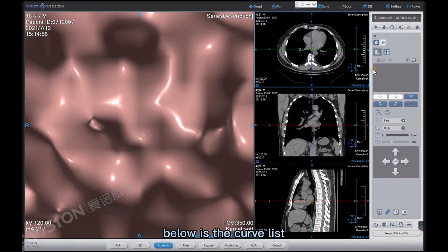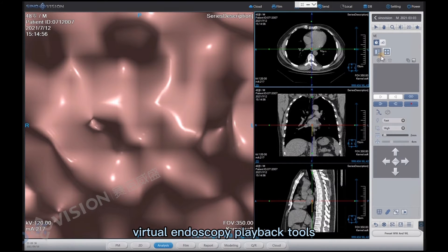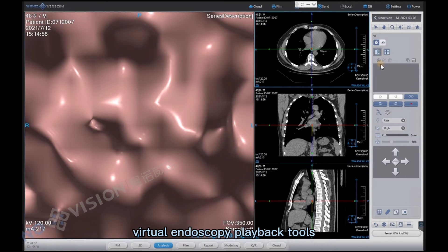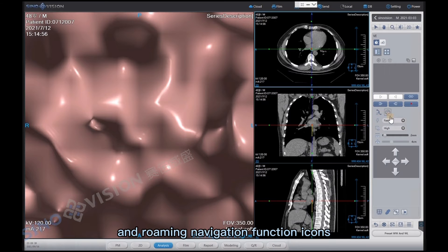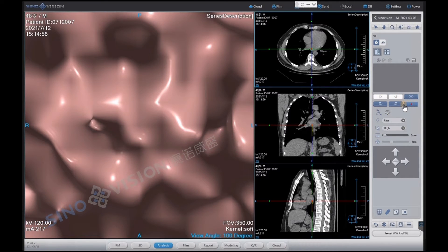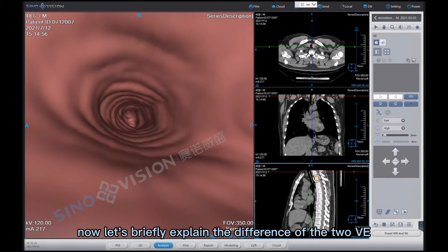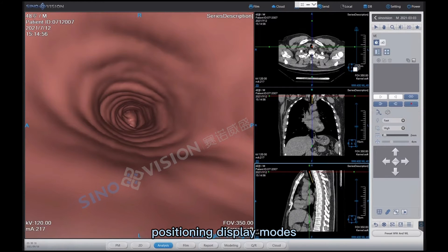Below is the curve list, virtual endoscopy playback tools, and roaming navigation function icons. Now let's briefly explain the difference of the two VE positioning display modes.